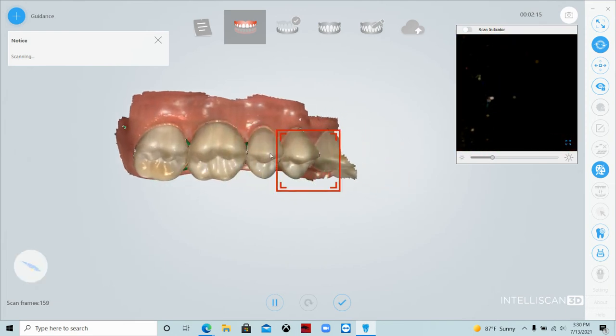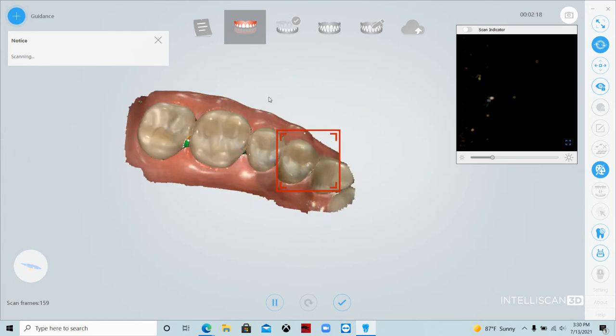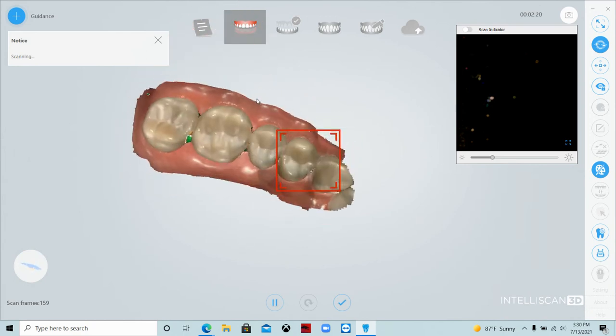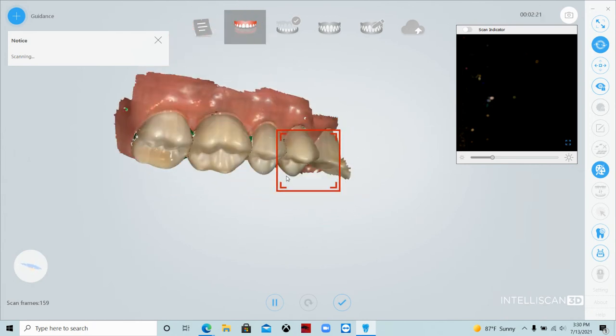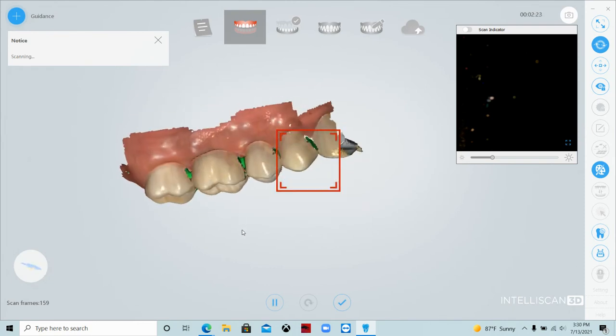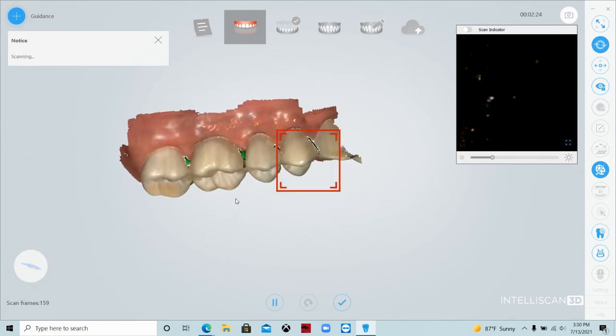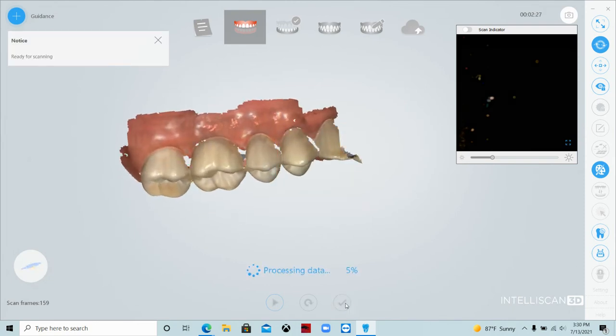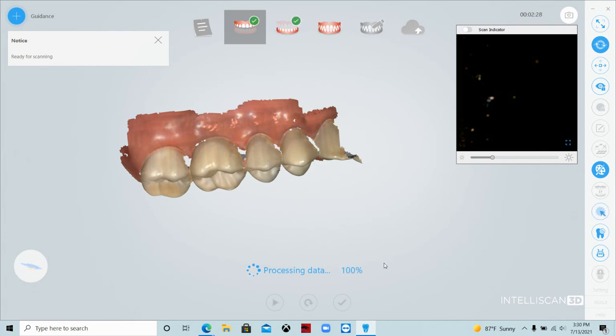Because it's the opposing, I can take a look at it and see what I've missed, but I'm confident that's good enough. Those holes on the lingual are not critical at all to my restoration. So I went ahead and click the okay button.